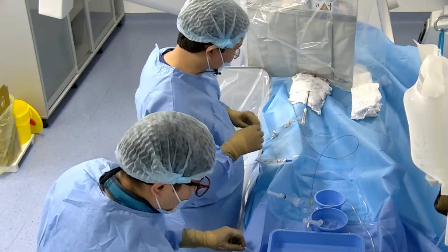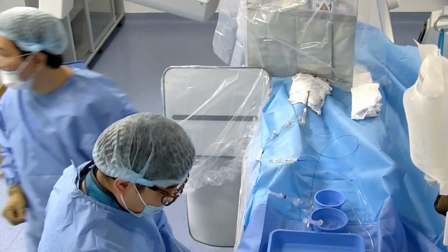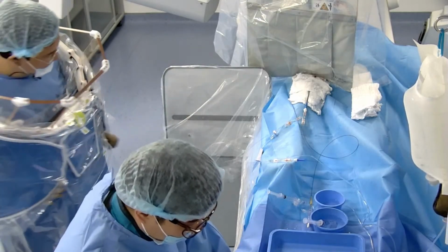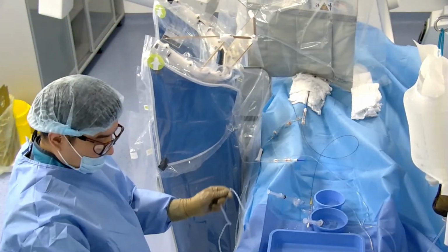Yes, all the products on the table have a certification in Kazakhstan. That's why it's no problem to use them. Okay. And for that reason we need a coil 3 by something.